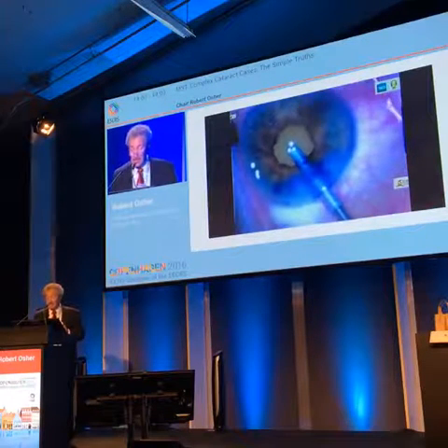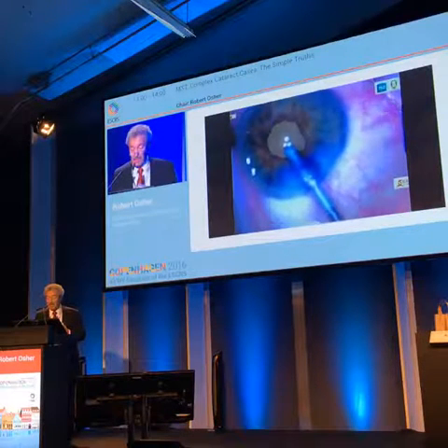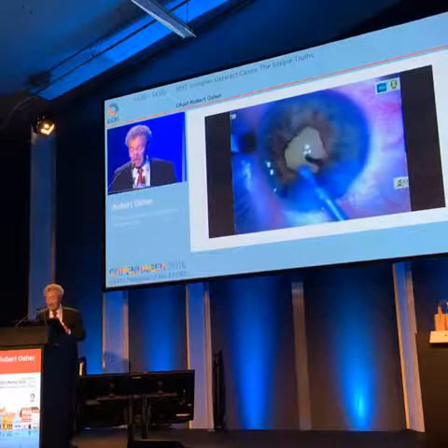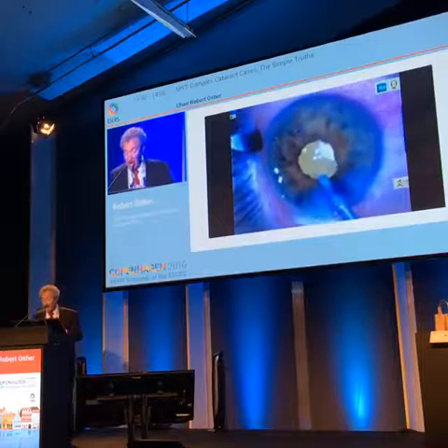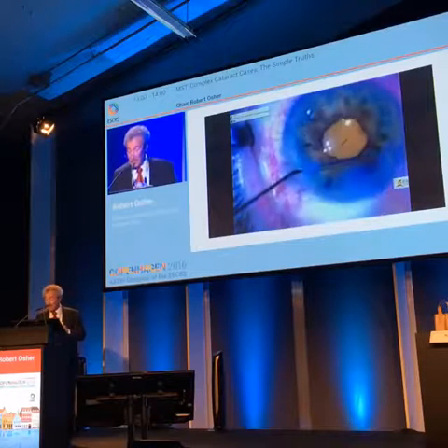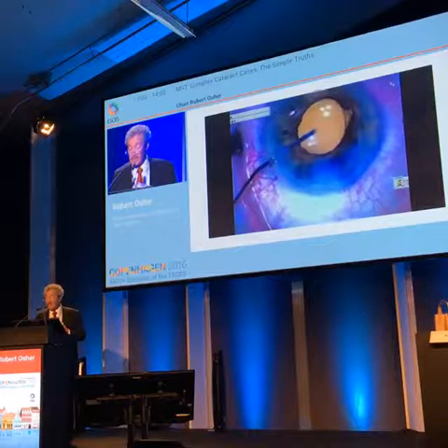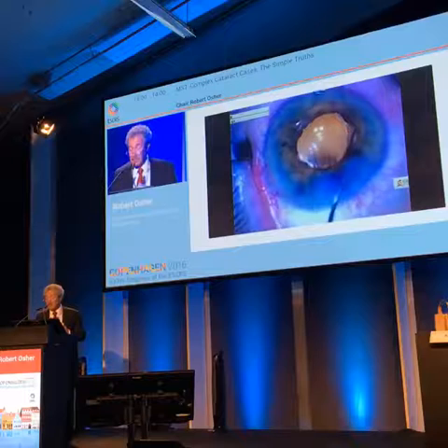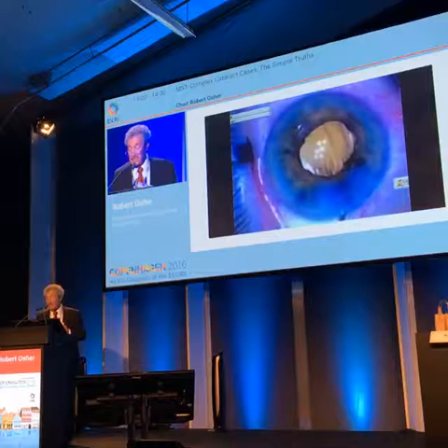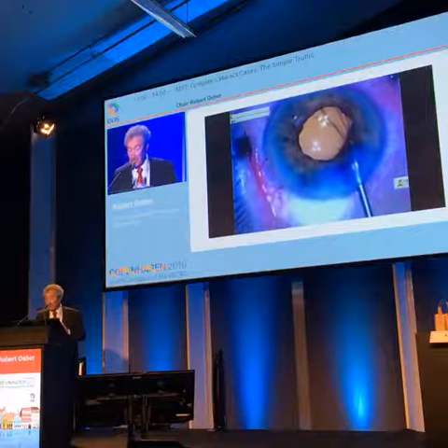So maybe I should have taken out the OVD first in this sequence. But now I've got this synechii, and I want to take it out. I forgot about the nevus. So I'm going to spend a little bit of time trying to take out the synechii, because I'm so terribly obsessive compulsive. It's a real disease. And see, there is a synechii there, but there's also a nevus. And I think I tried to remove them both, which clearly didn't work.